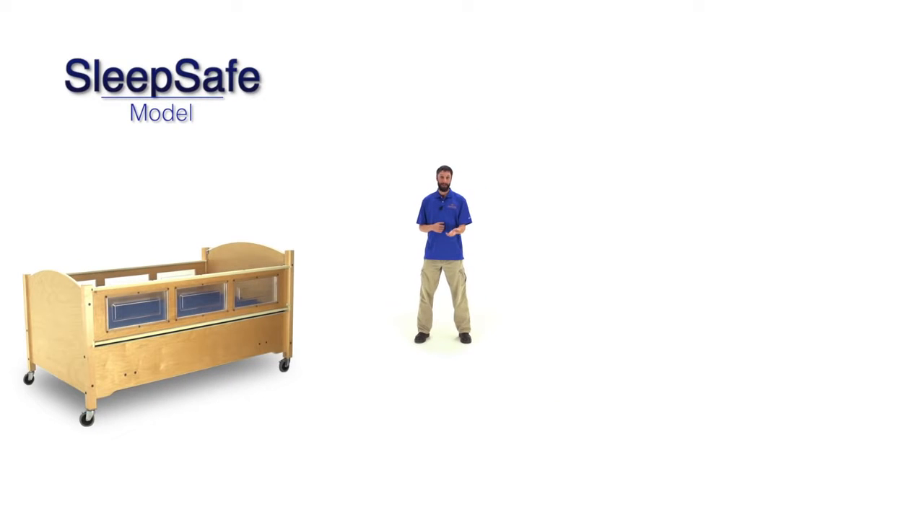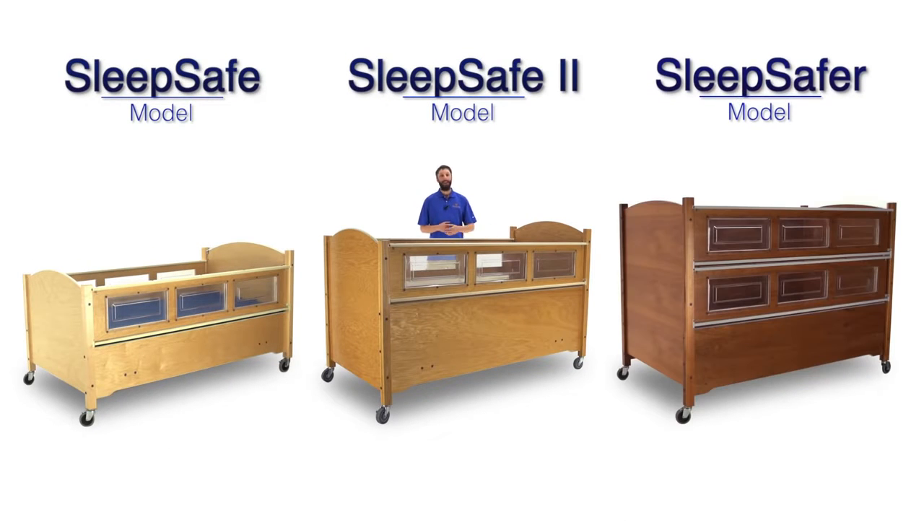We offer three models: the SleepSafe, the SleepSafe 2, and the SleepSafe-er, each individually designed to suit a variety of needs. The main differences between our models deal with safety rail height and transfer height.